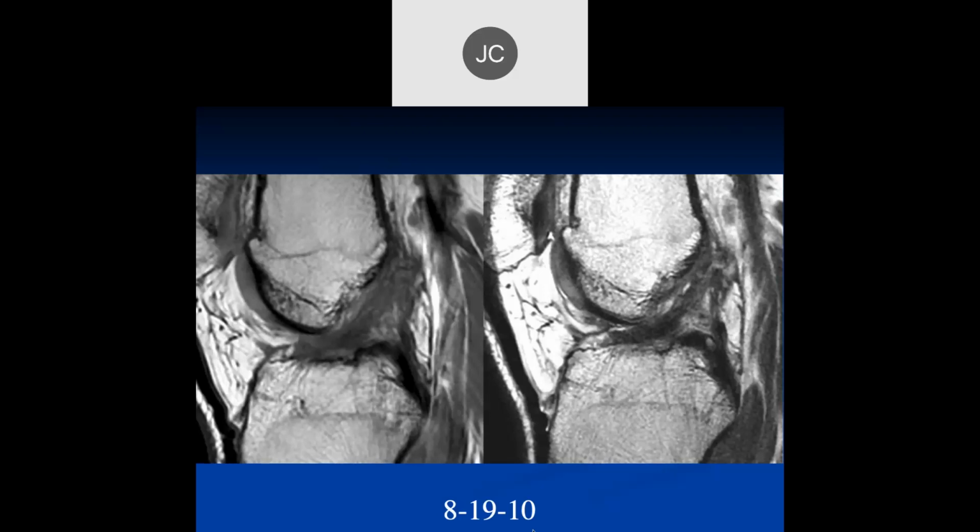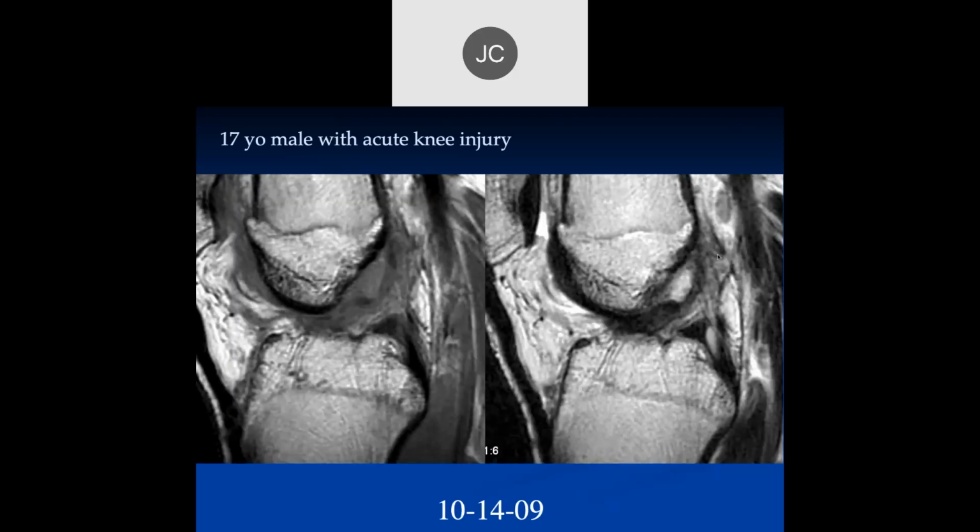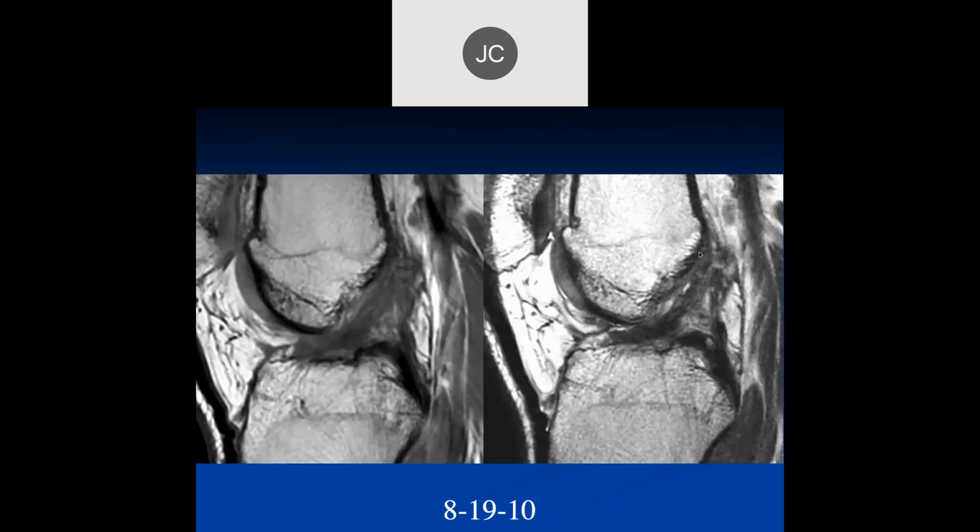Yeah, so okay, the ACL, I mean we see some fibers, but I think it's still... Yeah, so here's the tear before. Now we can see that in the area where you have that tear, there are some fibers with the meniscus. The ACL looks very bowed here, doesn't look very taut. And so you can get healing of the menisci occasionally, of the ACL occasionally.